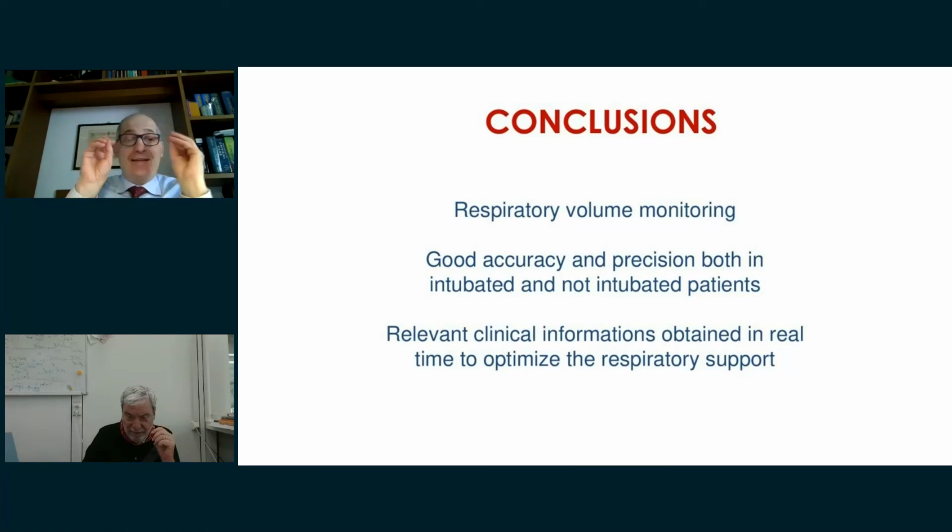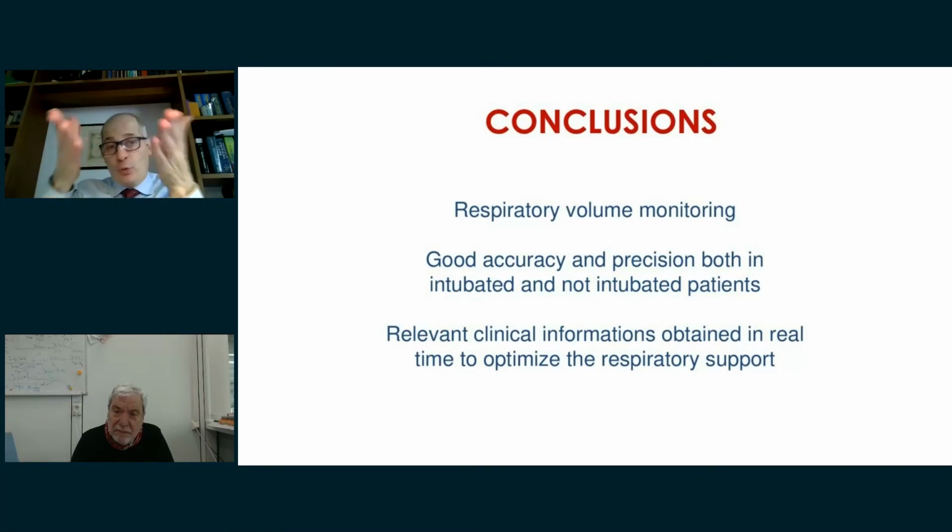So you don't have an exact idea of the inspiratory effort. But for example, you can also look at the change in central venous pressure to have an idea regarding inspiratory effort, and also look at the patient, for example, to see the muscles.